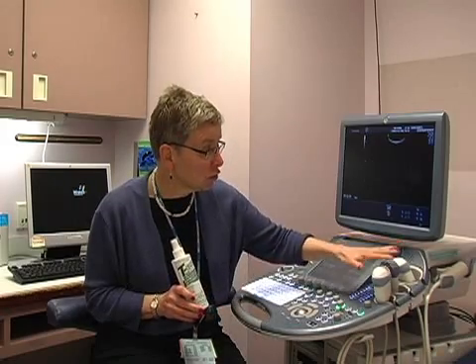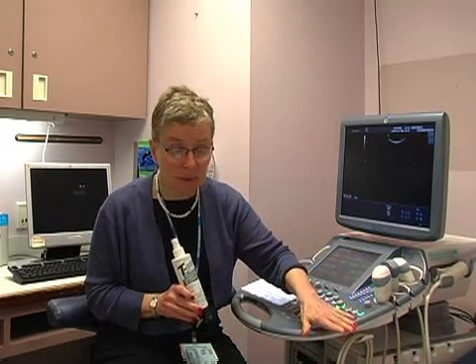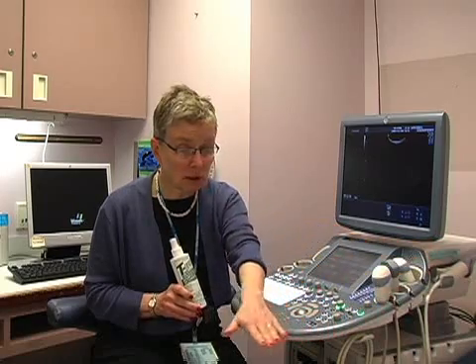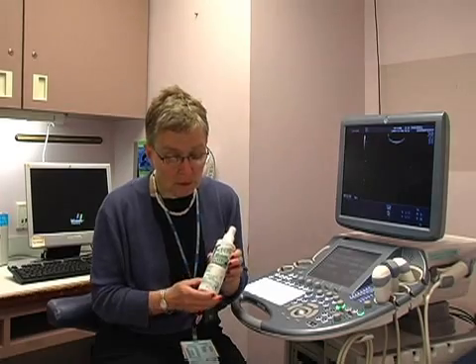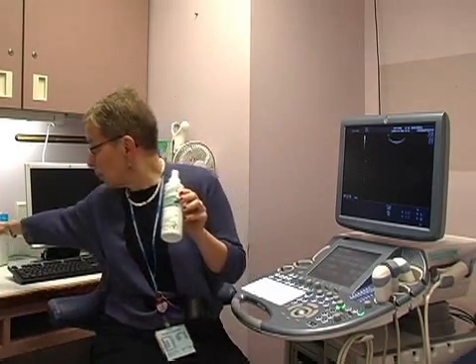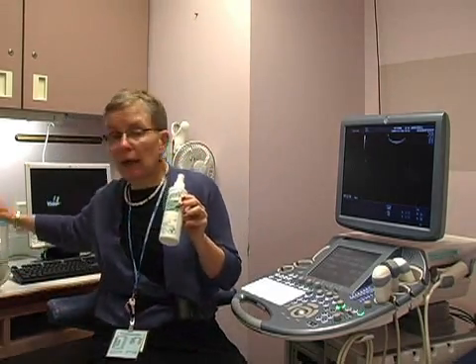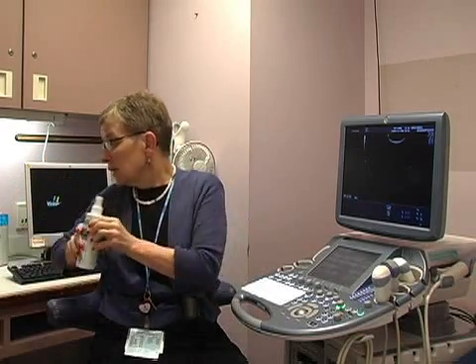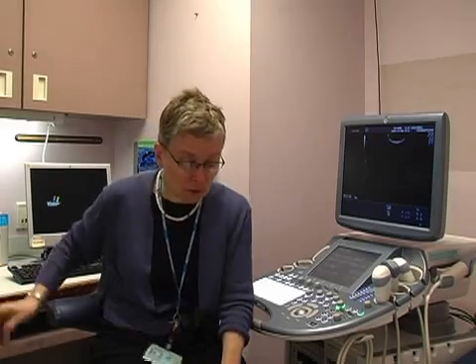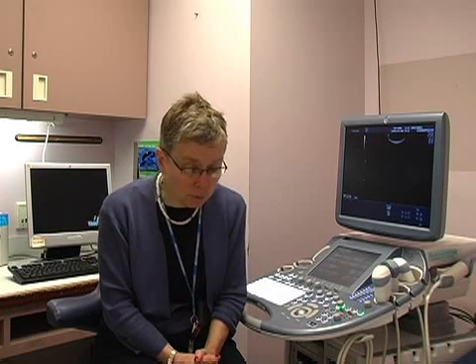That includes making sure that your table has been cleaned, that we change the cover on the table for each patient, and that our probes are cleaned. Something that we use is a disinfectant spray or cavi wipes. Care must be used that you use something that is not going to damage the surface of the ultrasound probe itself. When doing an ultrasound on a patient, a glove should be worn.